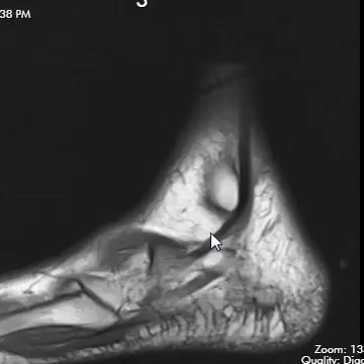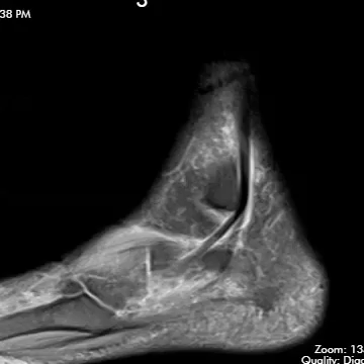Since the pain was more lateral than medial, we decided to bring the patient back and do another sequence with the foot in plantar flexion.